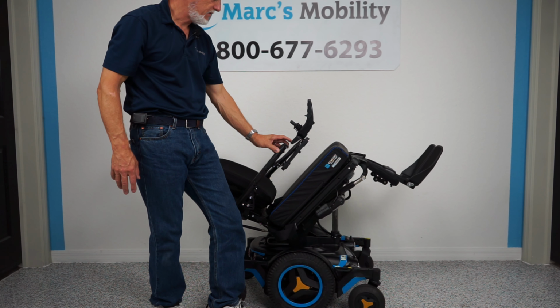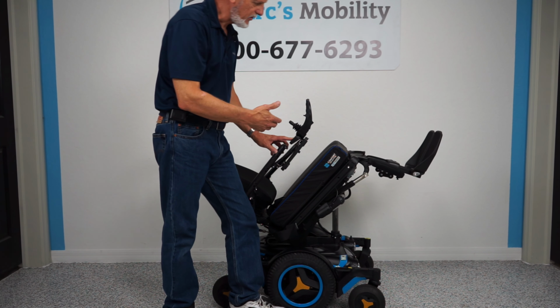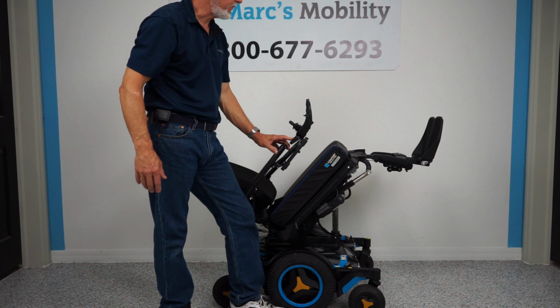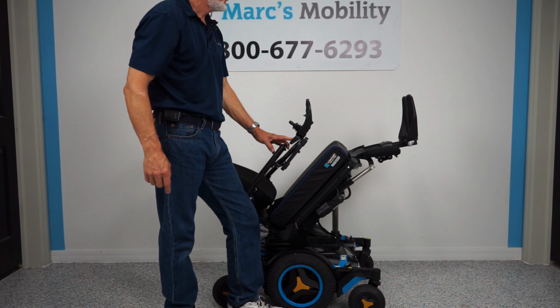The next function I'm going to show you are the feet. So these are the electric feet, and these are adjustable. So if you're 5 feet tall or 6'2", now they're short right now because whoever had this chair was probably a short person. There goes your feet. And so we can adjust these. You can see the poles can be adjusted over there. So these are your electric feet.